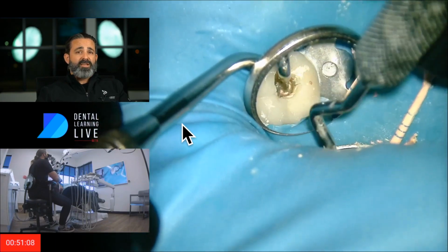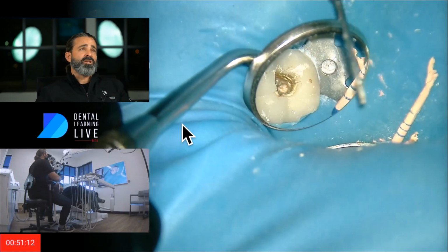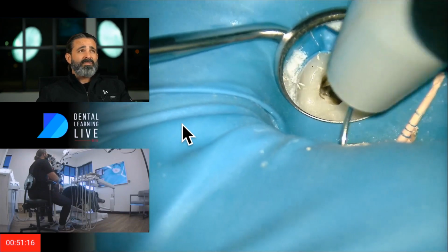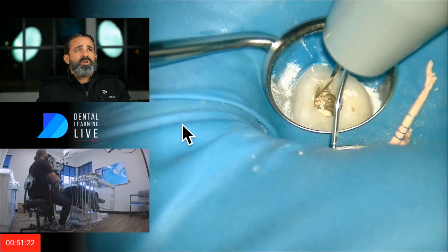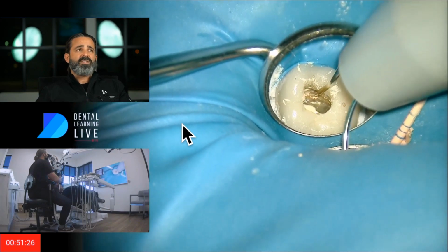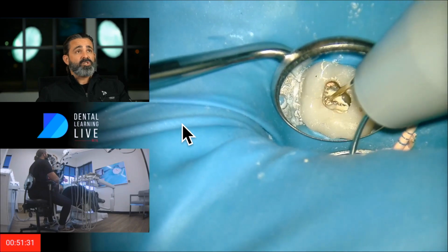When I'm at slender sizes, when I'm being a minimalist and I'm employing the GentleWave and I've got my sizes really small, 1504, 2004 at times, maybe 1506, somewhere in those ranges, and those canals were calcified to begin with, they're very slender and very tight. I'm actually, for sure, always using BC in those situations.